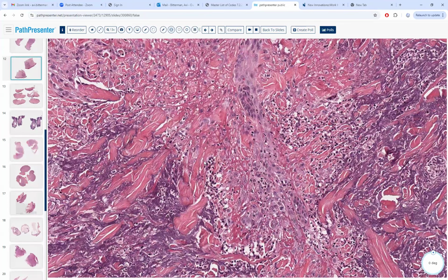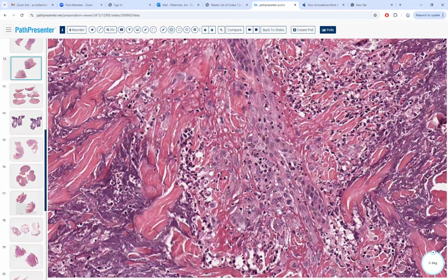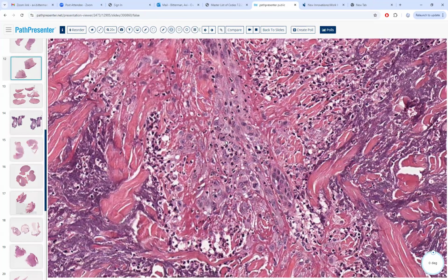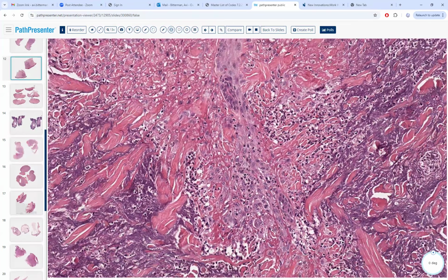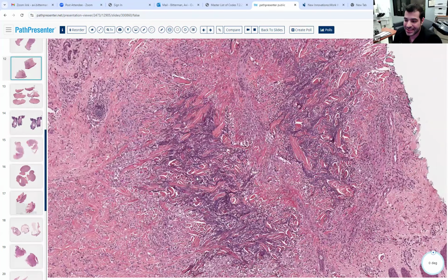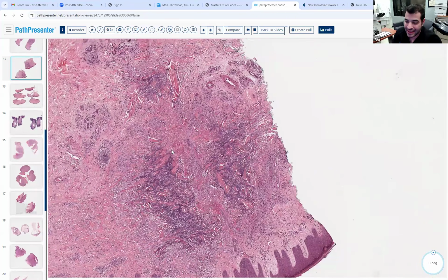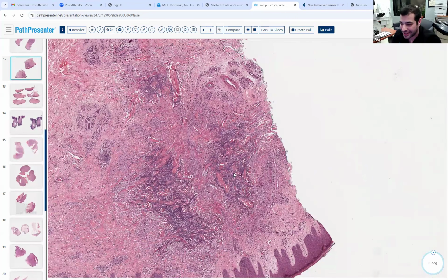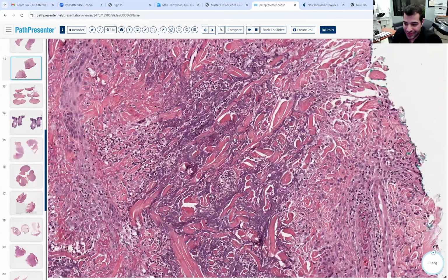Is it all lymphocytes or neutrophils? Neutrophils. There's also dust here from the neutrophils, karyorrhexis. And the other thing that's been described is collagen degeneration. I've found that helpful because I see these thicker, redder collagen bundles near the palisades. I don't know if that's a well described thing, but whenever this comes up on exams, I just happen to notice it.